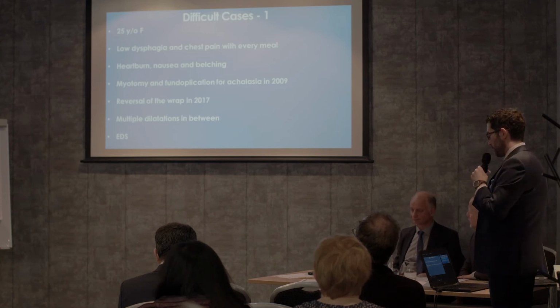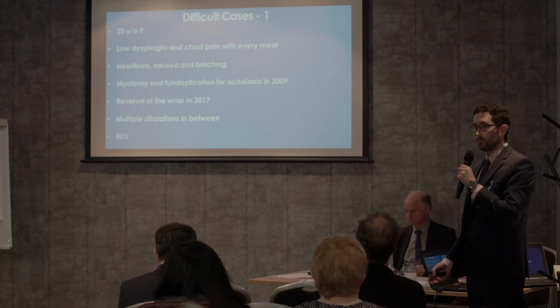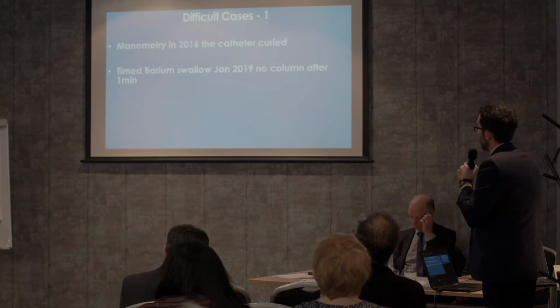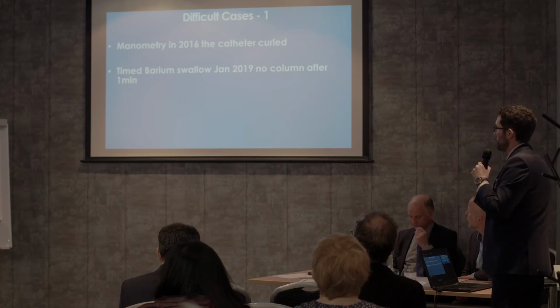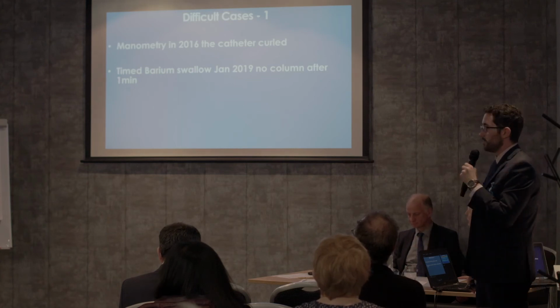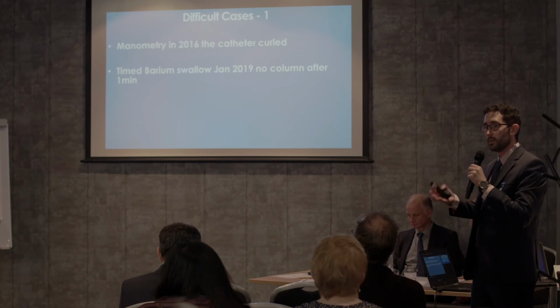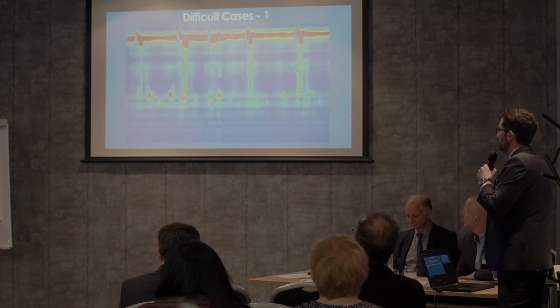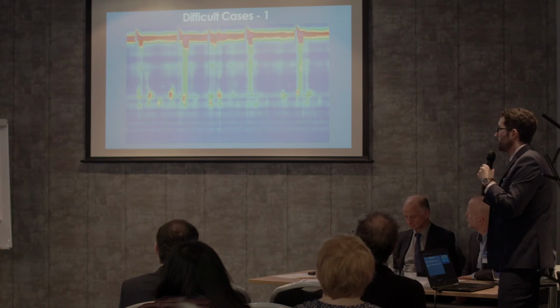The previous manometry done a few years ago, unfortunately, was curled, so that didn't really show anything. And the timed barium swallow done just before the trace showed that there was no column after 1 minute, suggesting that actually outflow is okay. And that is what we got with the 5 mL swallows.